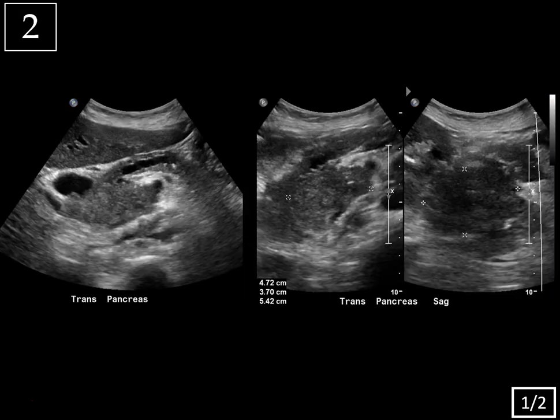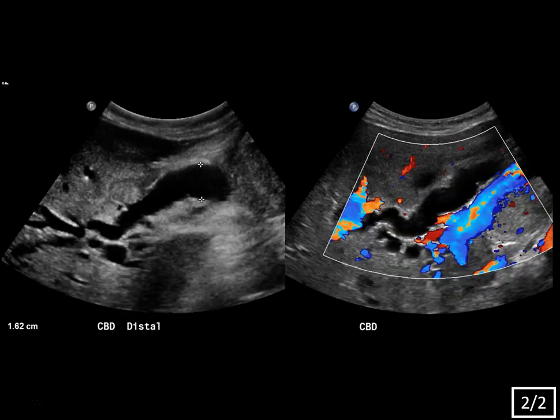Next case, slide one of two, pancreas. Slide two of two.